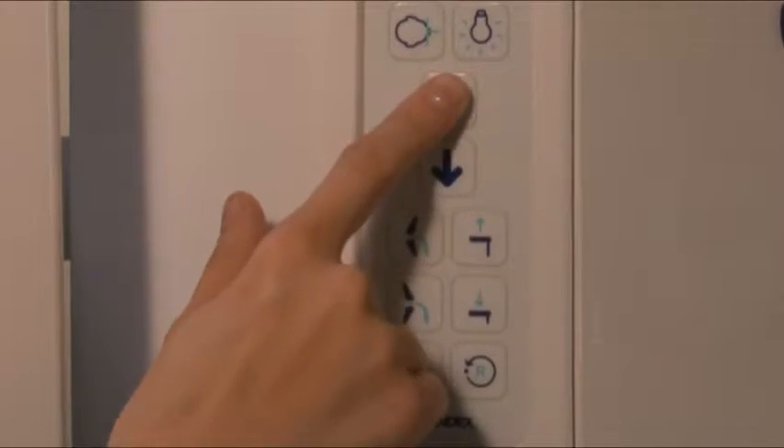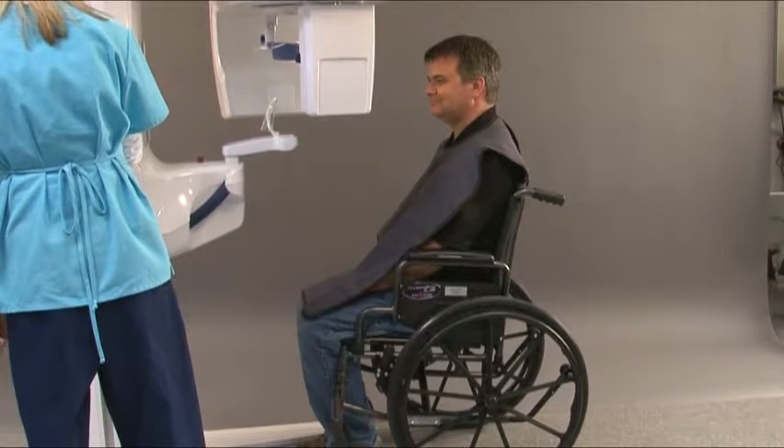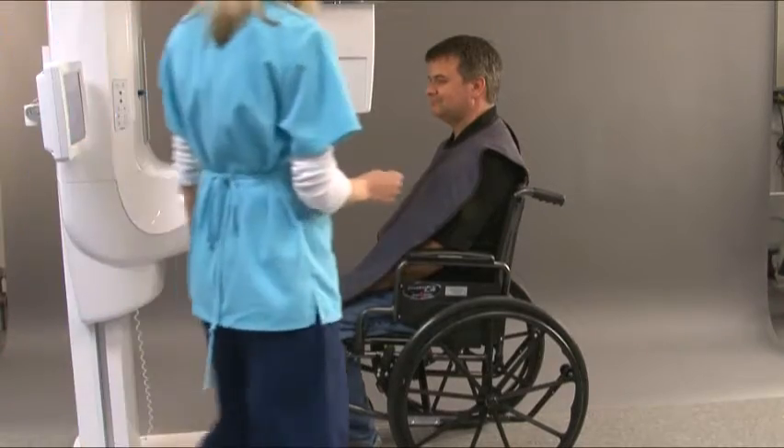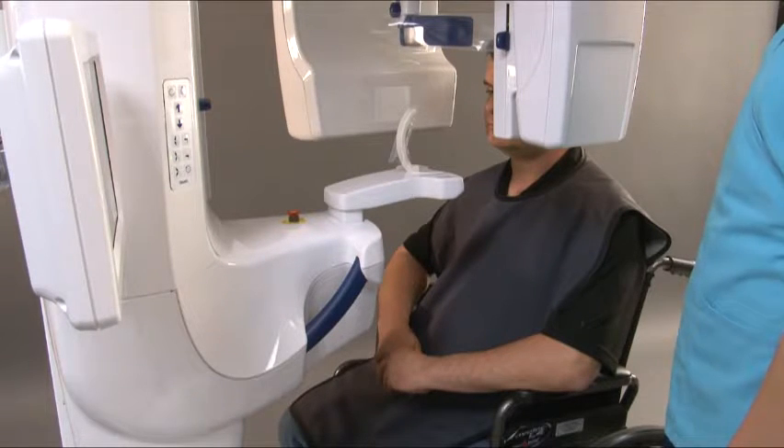Press the up-down buttons to adjust the height of the chin rest so that it is slightly higher than the patient's chin. For open TMJ, ask the patient to open their mouth as he or she approaches the unit. For closed TMJ, the patient should approach the unit with back teeth clenched.